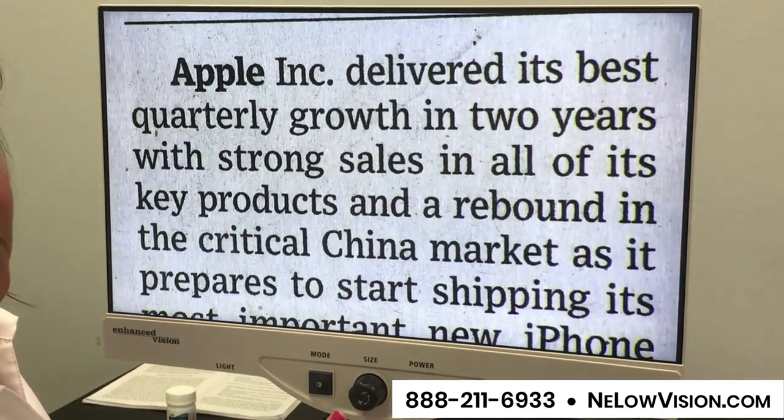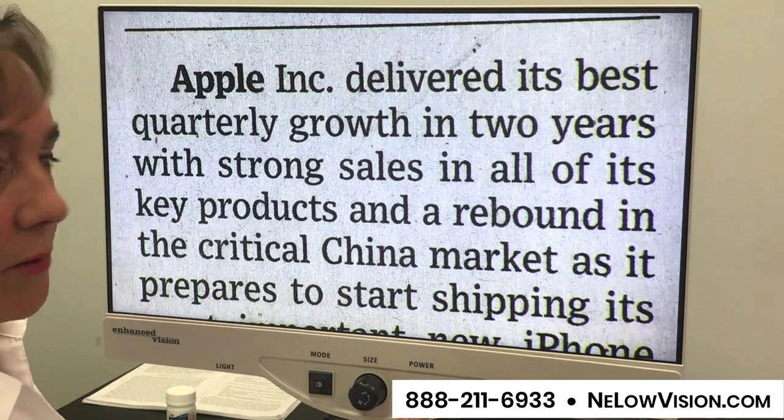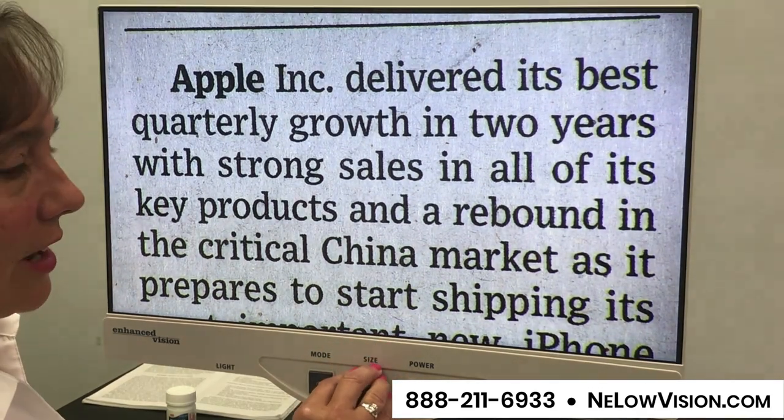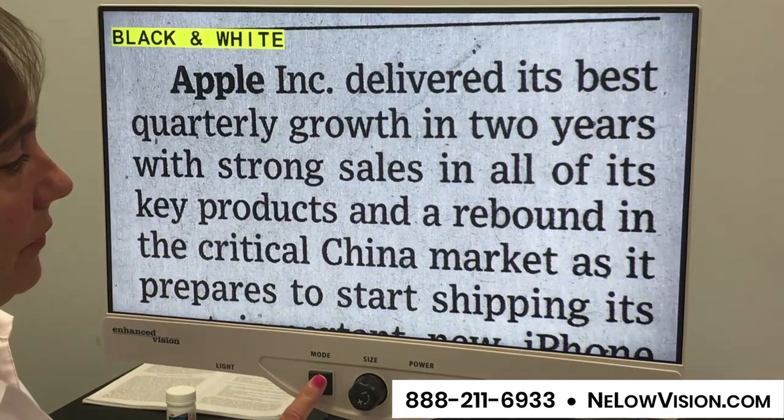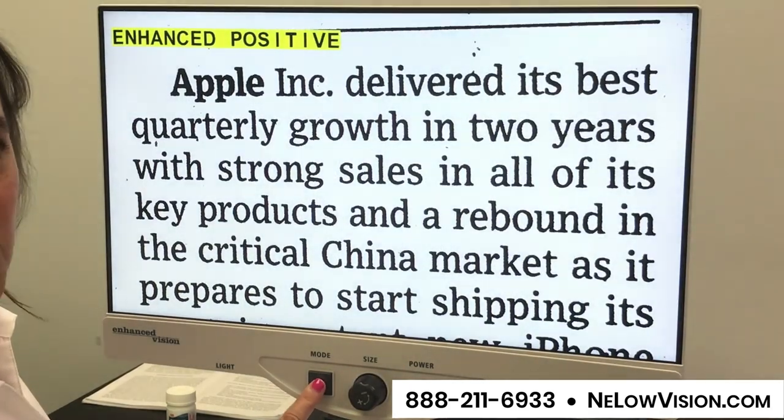Very easy to operate this machine. So you have an on/off button, you have a dial just for adjusting the magnification, and then one more button to the left is going to adjust your contrast.